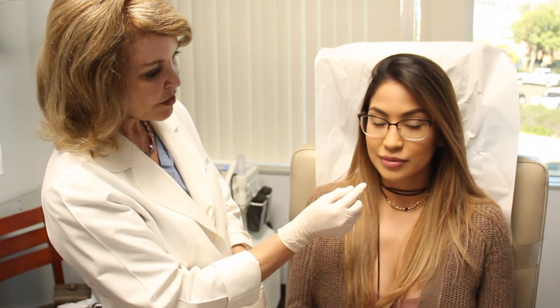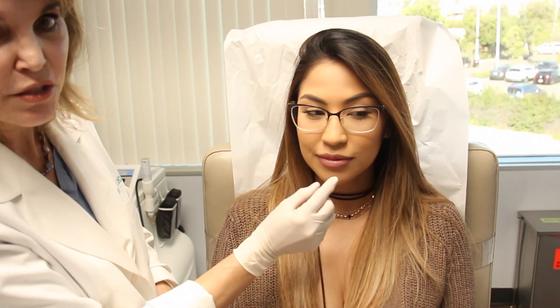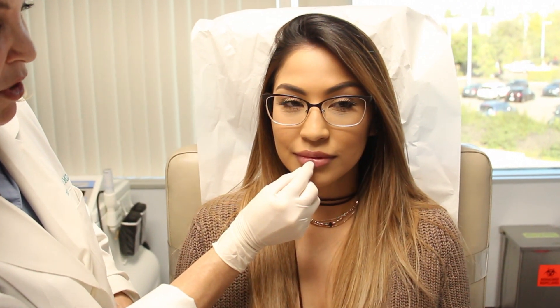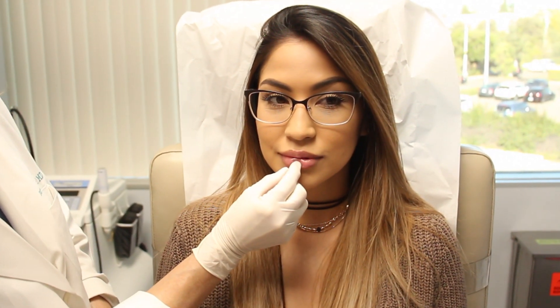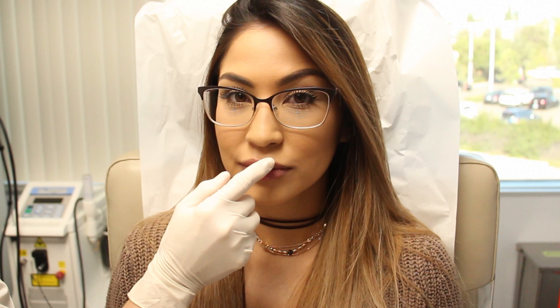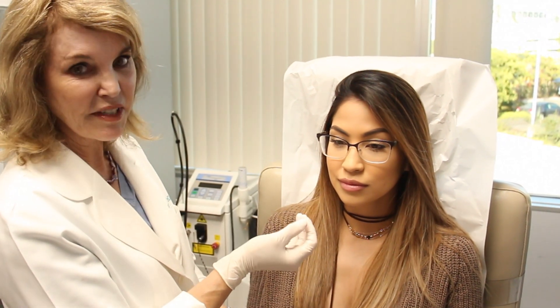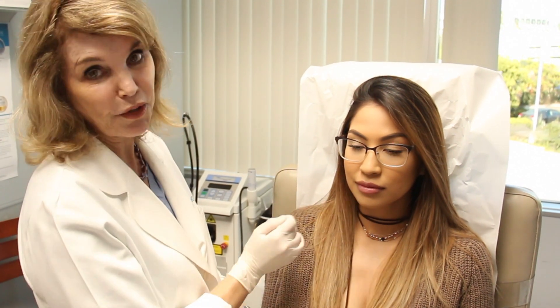The keyhole pout is when we use a little string — or in this case a medical iodoform gauze — to put a little dent here so that we accentuate the pillows of the lip. There should be four pillows with a little depression in the center, and that gives the natural way that the lip should look. So keyhole sounds artificial, but it really makes it a beautiful pillow lip.